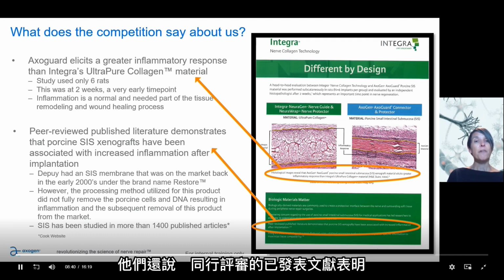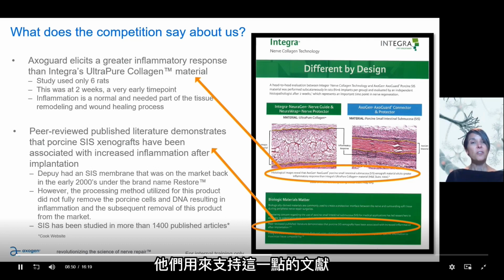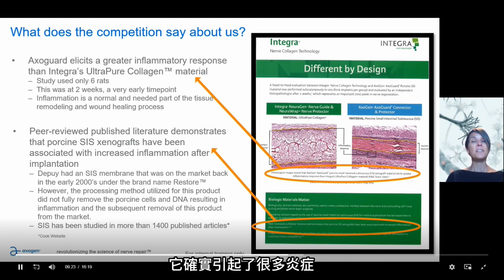They also said that peer-reviewed published literature demonstrates that porcine SIS xenografts have been associated with increased inflammation after implantation. And the literature that they use to support this is based on a DePuy implant, which was made from SIS, and it was on the market back in the early 2000s under the brand name Restore. And the problem with this product was that the processing method that they used didn't fully remove the porcine DNA. And so it caused a xenograft response when it was implanted. And so it did cause a lot of inflammation, and the product had to subsequently be removed from the market.